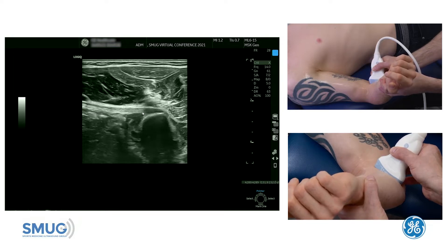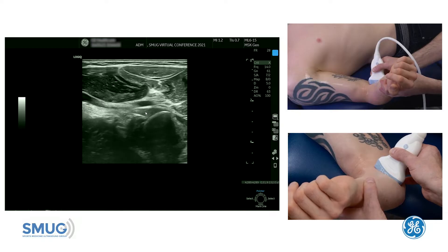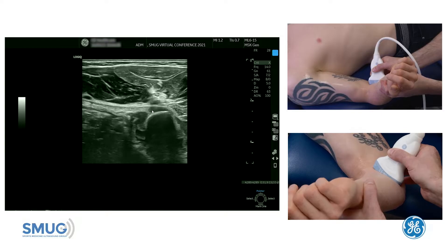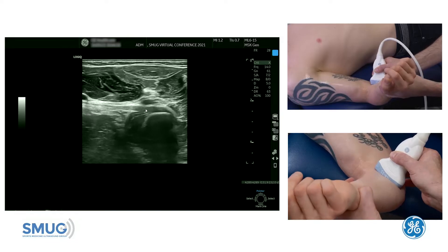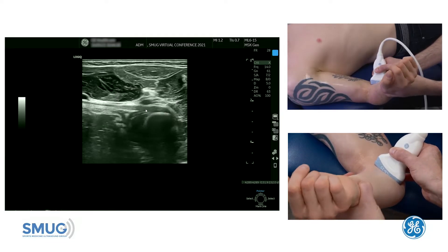Once you have that picture you can go slightly more proximal — that's more the long head of the biceps — or you can go distally, which is more the short head of the biceps. Sweep through it slowly, and the last thing you may want to do is a dynamic test, which is pronation and supination to see how it behaves dynamically.